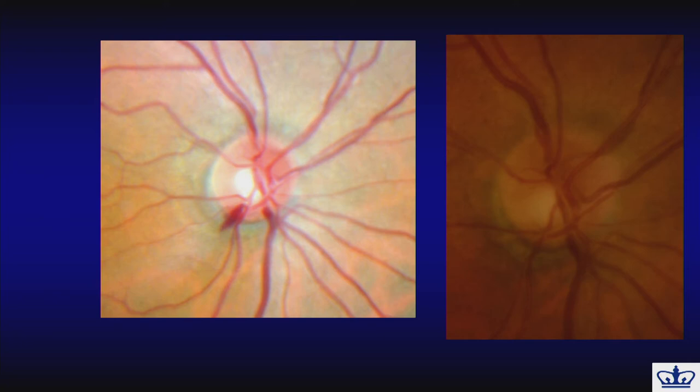It's occurring in the macular vulnerability zone described by Dr. Hood that points to the inferior macular region and the superior paracentral visual field region. It's critically important for patients in their ability to function. Many years later, on your right, this patient has developed a notch nearly all the way to the inferior rim at the site of the prior notch and the disc hemorrhage, which signaled that progression was going to occur.